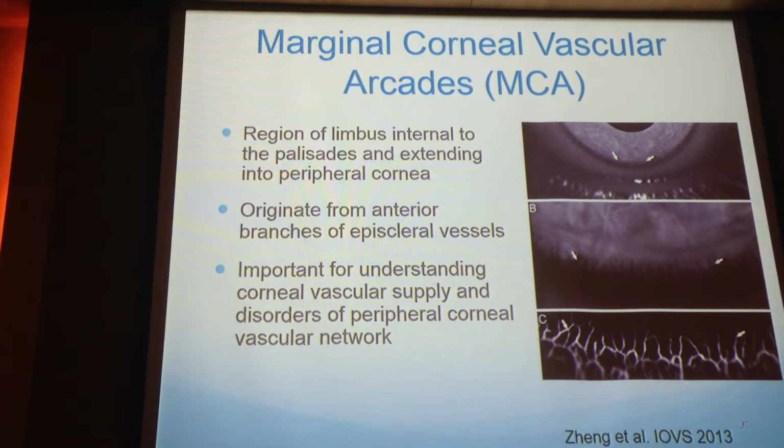Some people have continued their work from a research point of view. This group is from Liverpool, UK, and they have used ICGA to try and study normal limbal vasculature to look at the potential of studying ocular surface disease.